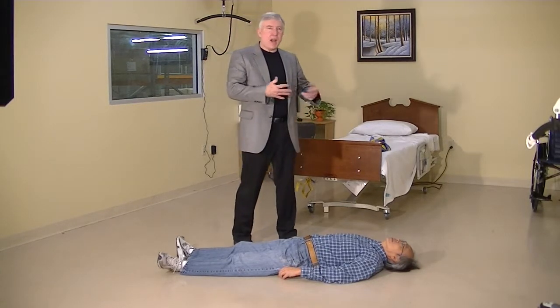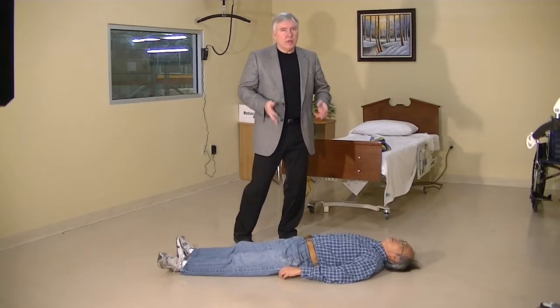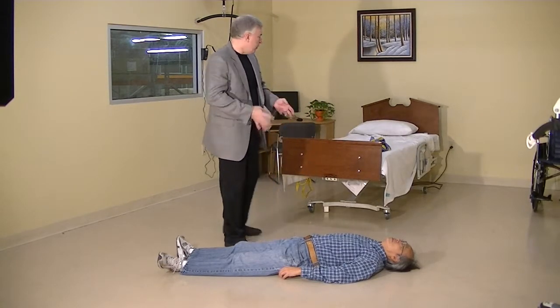Sometimes a patient can slide out of the chair, slide out of the bed, and they end up on the ground. It's a difficult transfer. Let's show you how it's done.